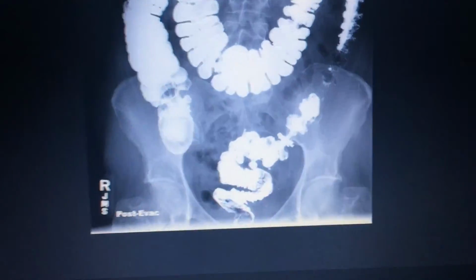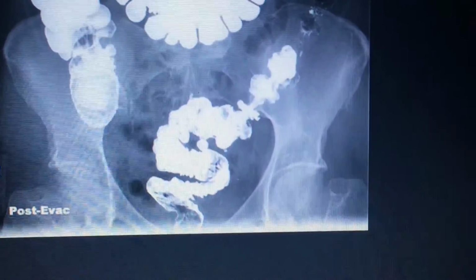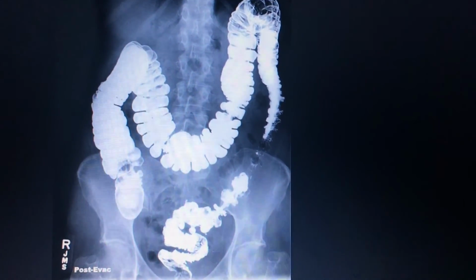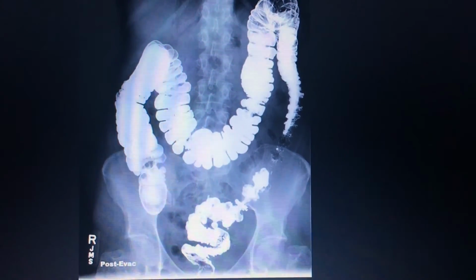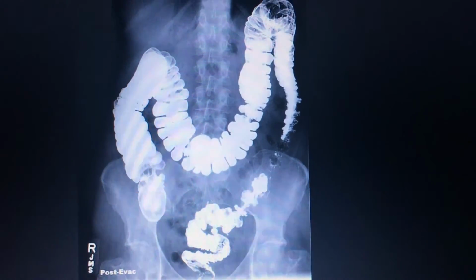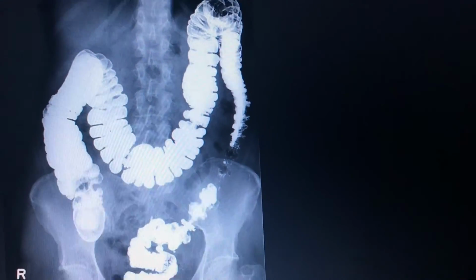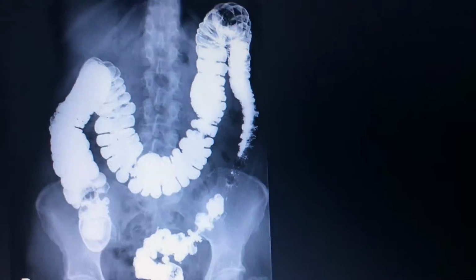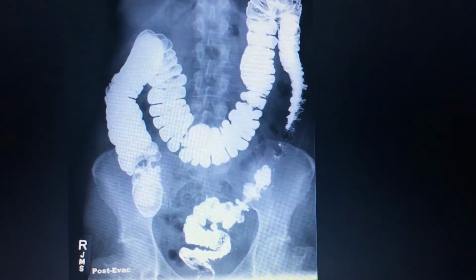And last but not least, the post-evac. After the tip has been removed, patient has evacuated. We want to see what's going on there. Still looks somewhat dilated. A lot of barium residue still in there. That's to be expected, especially when you have some pathology there. Some Crohn's disease. It's going to cause some restriction, not dilation. So it's going to be a little harder to get out.